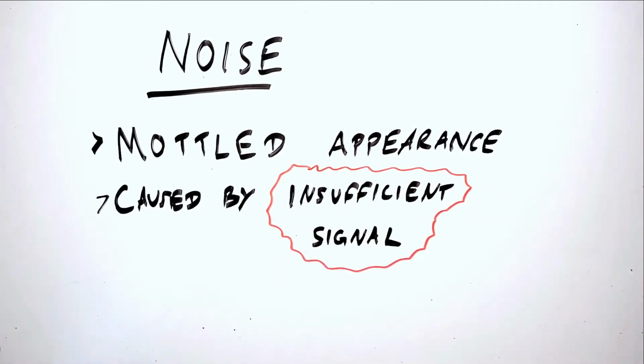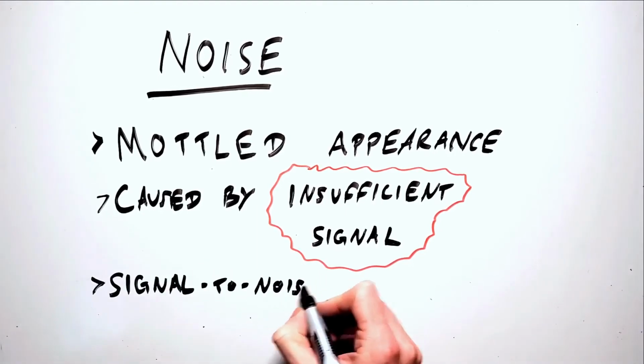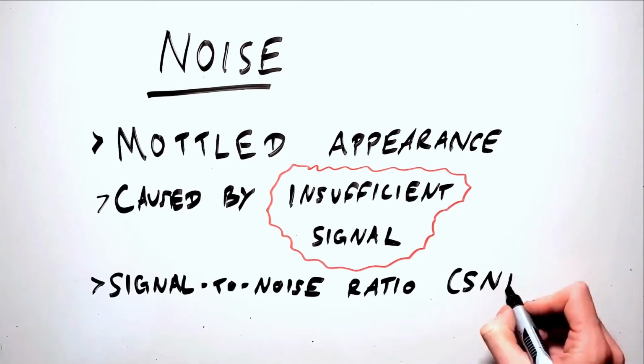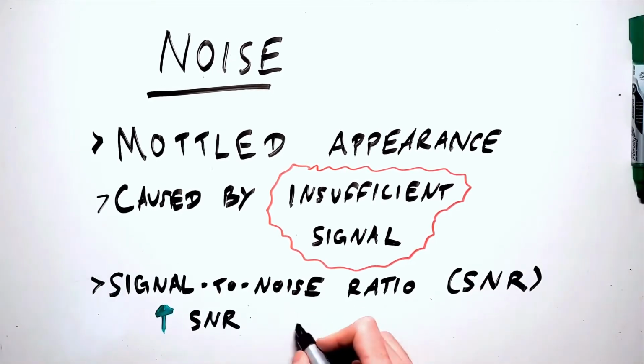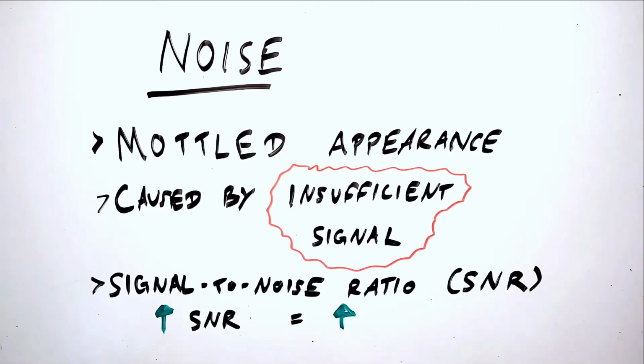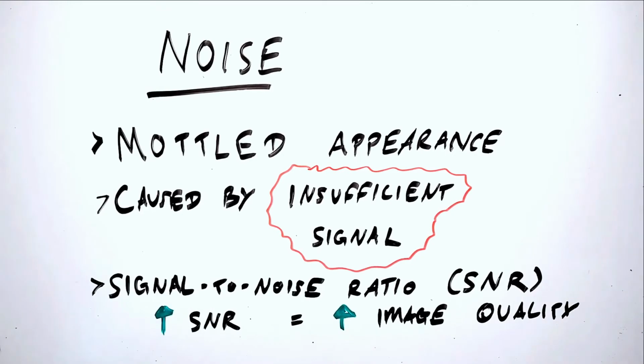In any set of data, there will be some inherent random fluctuations disrupting the incoming signal, which we can't account for, but the more true signal we have in this data set, the less noise we will have. This is described as the signal-to-noise ratio. So a high signal-to-noise ratio means that we have a relatively higher amount of true signal in our data and a relatively lower amount of noise degrading our data.